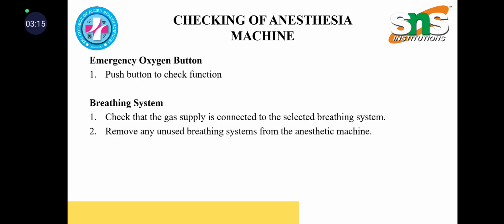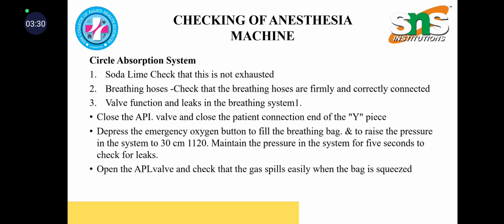Emergency oxygen button. Push the button to check function. Breathing system. Check that the gas supply is connected to the selected breathing system. Remove any unused breathing systems from the anesthetic machine. Circle absorption system. Check that the soda lime is not exhausted.